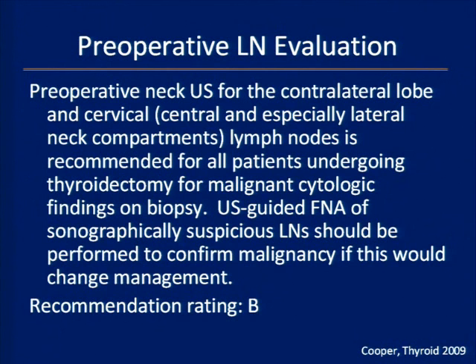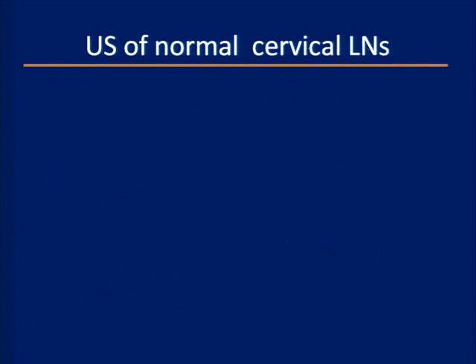And the key here is that for a patient who has thyroid cancer, had a biopsy, and is going to go to surgery, you really want to go back and do a preoperative neck ultrasound, look at the other lobe of the thyroid, look at all of the lymph nodes, and evaluate them before surgery, because lymph node metastases are not uncommon. If you see them prior to surgery, it really can help guide the surgeon and make sure the most complete surgery has been done, including a lymph node dissection.